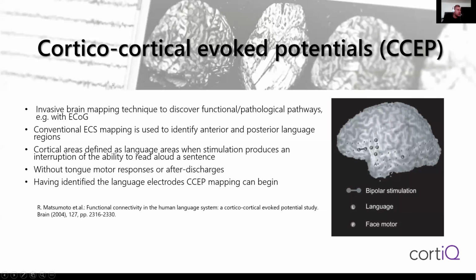Another stimulation technique is cortical evoked potential, so a single pulse electrical stimulation. The great benefit or good characteristic is that we are almost with no risk of inducing a seizure. So sometimes people are reporting that they can feel the stimulation, but it's not as, let's say, aggressive as the 50 Hertz stimulation. And here we don't have a symptomatic effect, so more or less the patient can remain in a resting state.